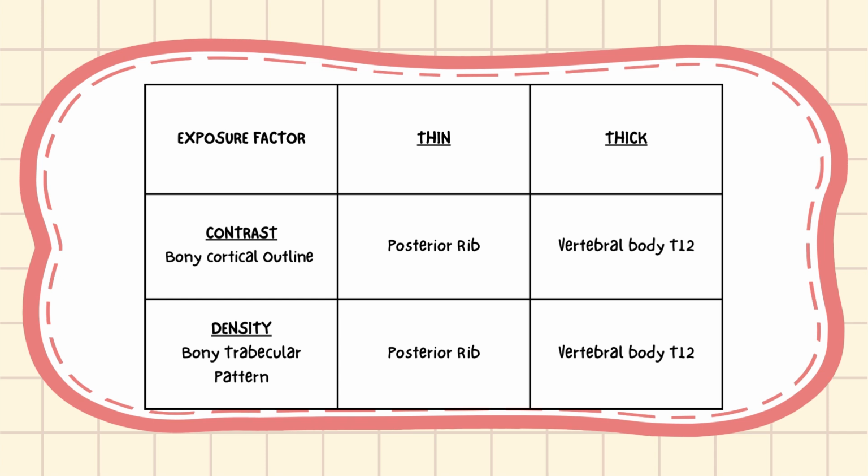Meanwhile, for the thick structure, we are going to evaluate the visualization of BCO and BTP of the T12 of the vertebral body, also to determine whether the exposure factor used are adequate or not.